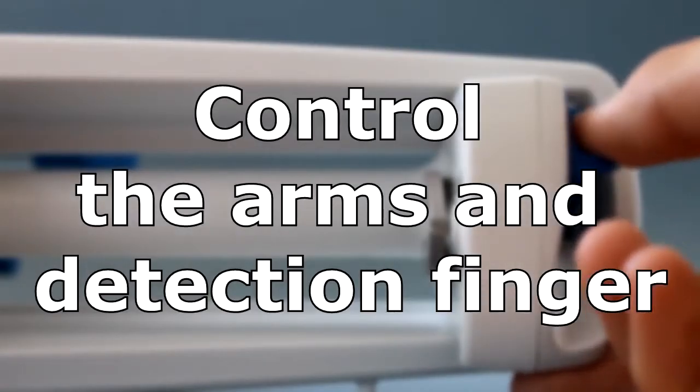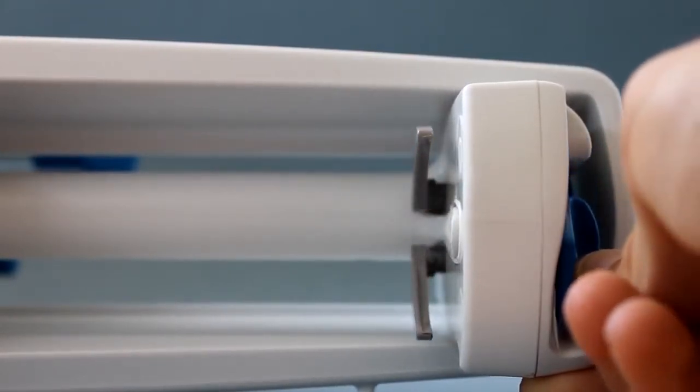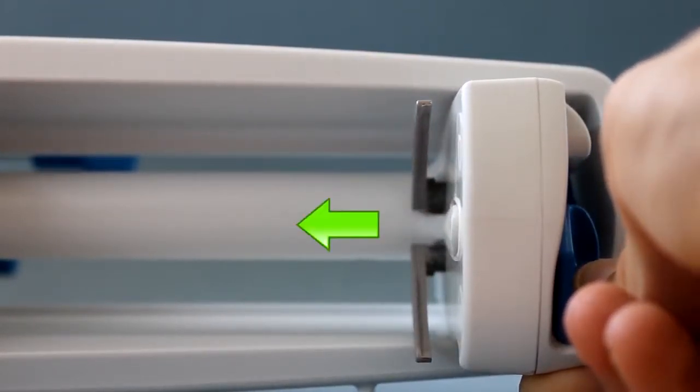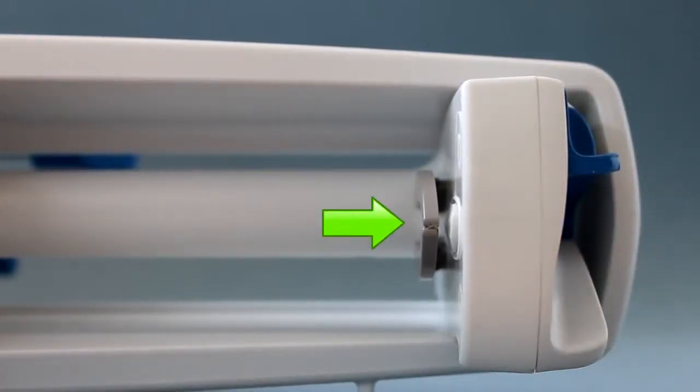Press the disengagement lever. Check that the anti-siphon arms move towards the syringe. Release the disengagement lever. Check that the anti-siphon arms are moving partially back. Check that the arms are symmetrical and in contact.